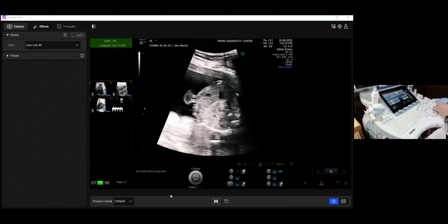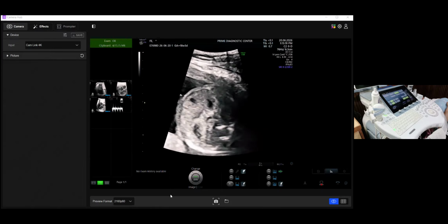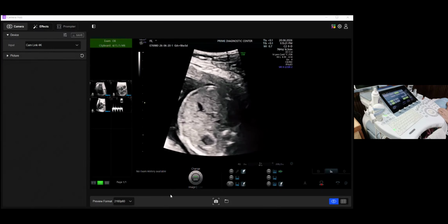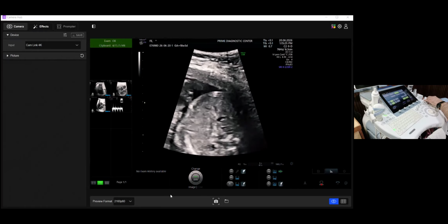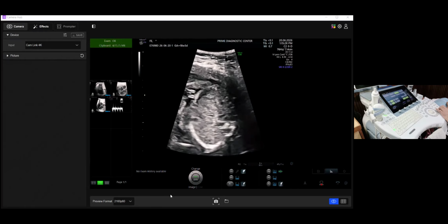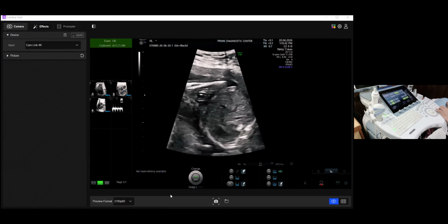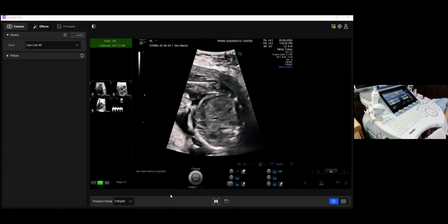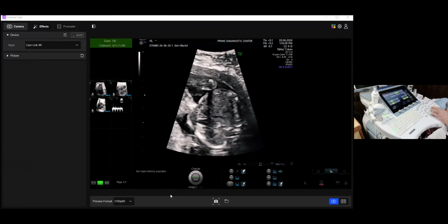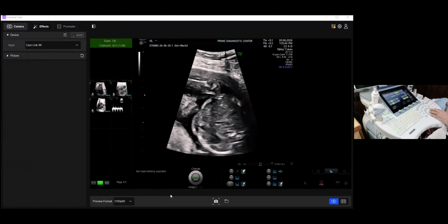So DV we have done, appendages we have done partly, and you wanted, okay, I remember, you wanted extended views. That was the most popular demand, right? So extended views. The trick is, you are now in this kind of situation, bradycardia can happen if I apply a little more pressure there, and that is a normal phenomenon.